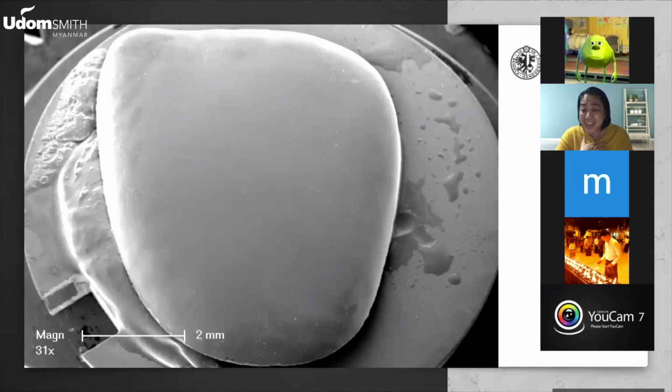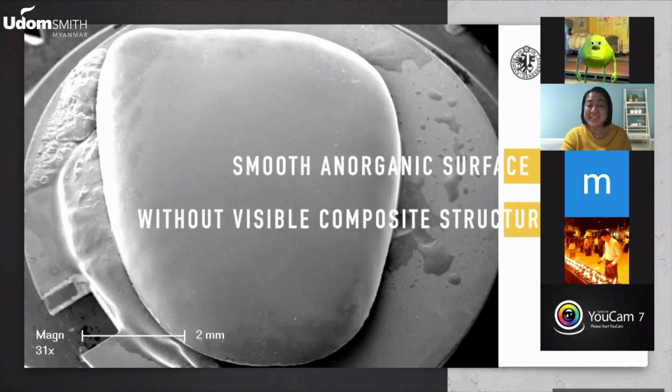I am ashamed to say that I am a smoker. And as you can see, for 4 years, my Edelweiss never had nicotine stains. The natural tooth at the back of it has nicotine stains. That is why if your patients have Edelweiss, do not use an ultrasonic scaler directly on it because it will scratch. Okay? It will scratch because it is made of glass. So in cleaning the Edelweiss, you just polish it. That's it. You don't have to do anything because it doesn't stain. Okay?